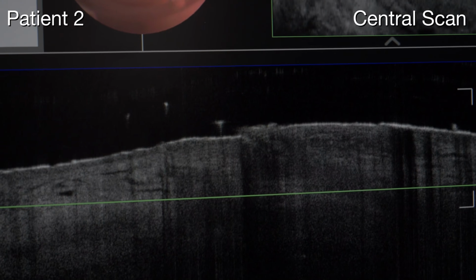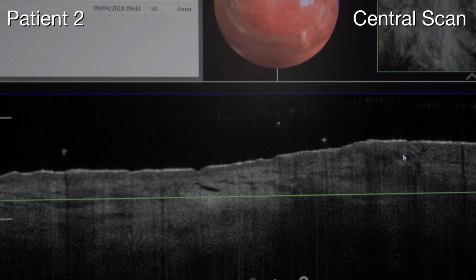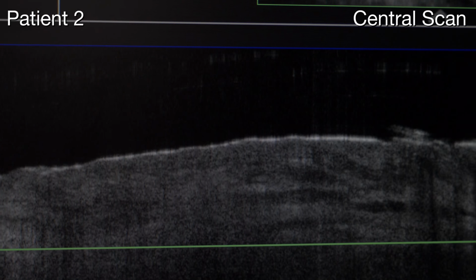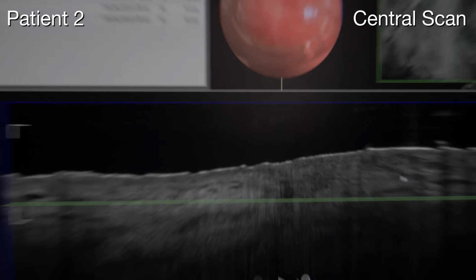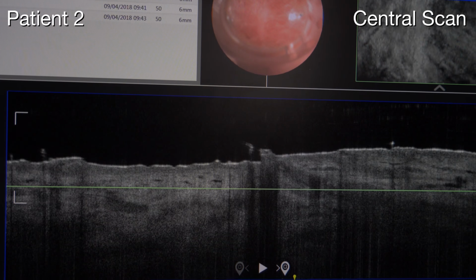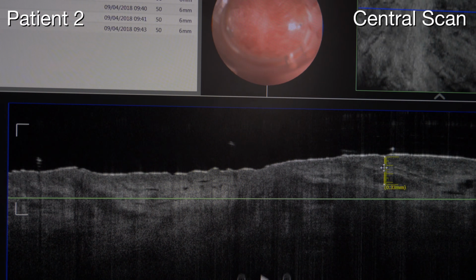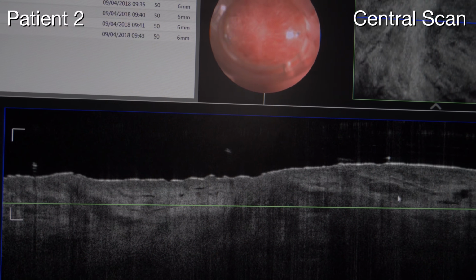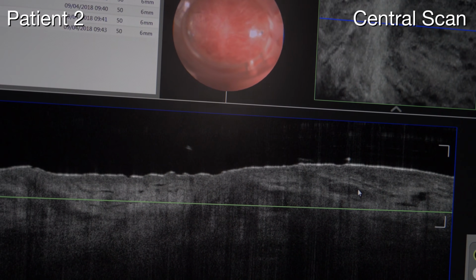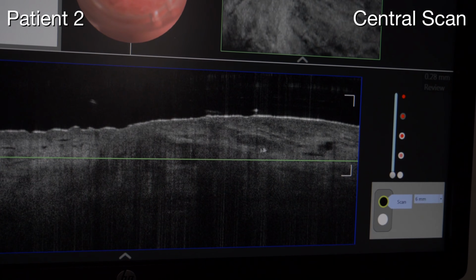And if we scroll through, we can also see one here. And there are a lot of blood vessels, of course. There's also the scar. Why does your pen mark shadow seem to disappear and then come back? There is no pen mark. Oh, there isn't. Oh, sorry. This is just the center. Yeah, this is just the center, but here we have also one very nice nodule.